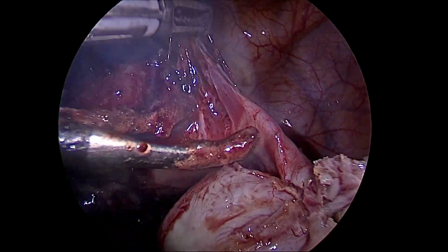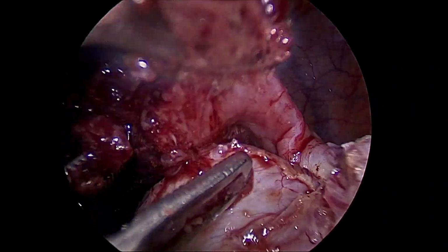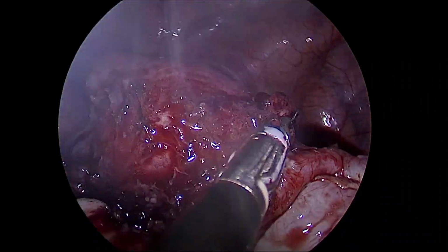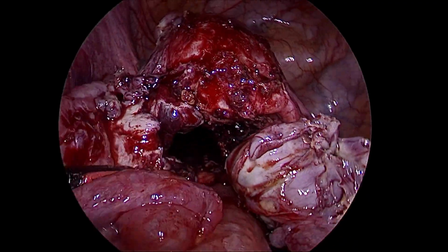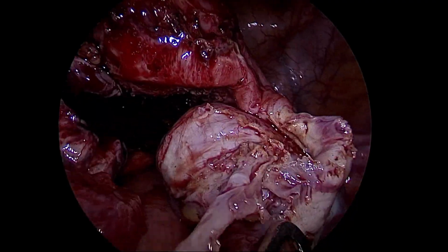These are again the peritoneal coverings which have happened over the fundus of the uterus. This was also detected on MRI, and we are removing them as well, so as to ensure that from pathology we convert to anatomy to the best of the possibilities.